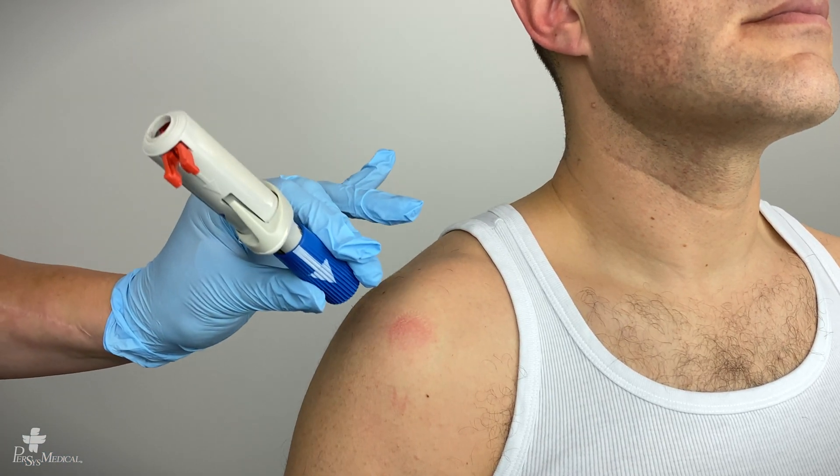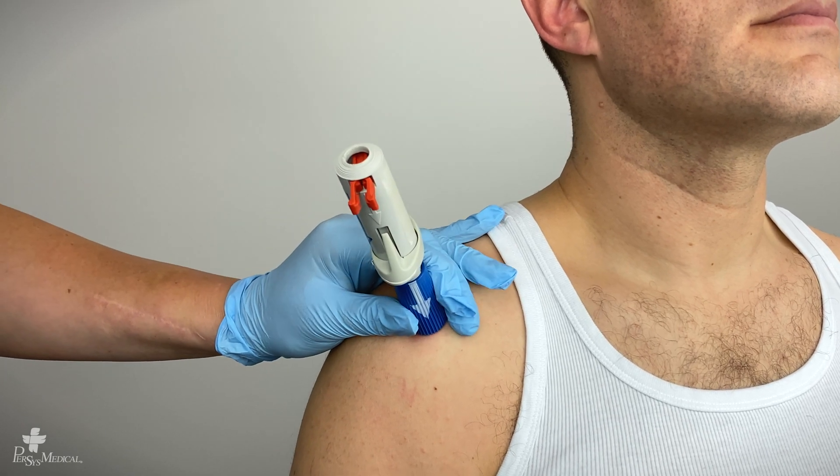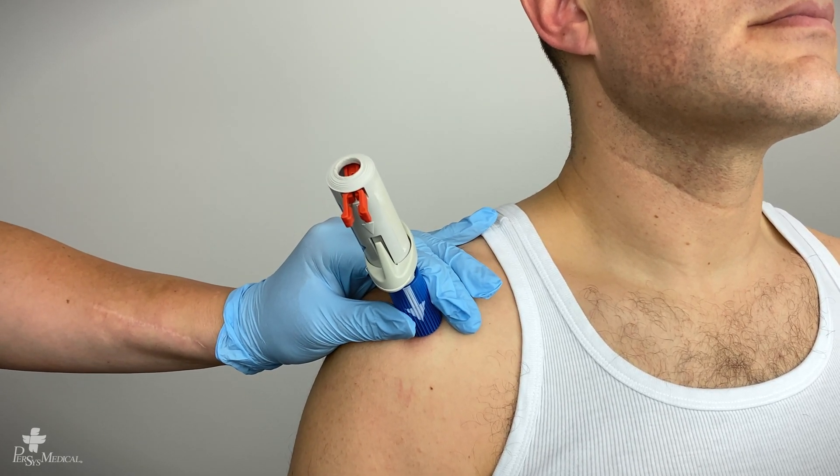This is the side against the patient's skin. Place the BIG against the patient's skin with your non-dominant hand. Press firmly 90 degrees to the patient's skin.